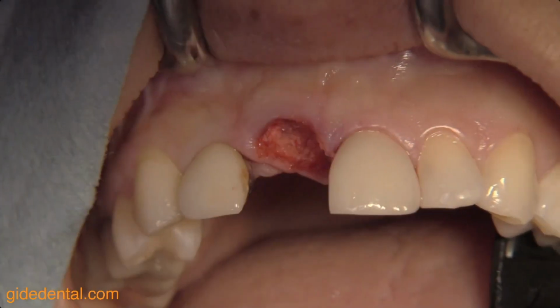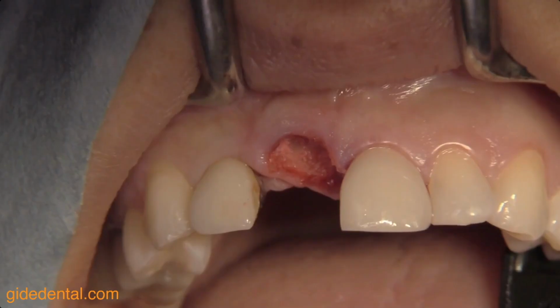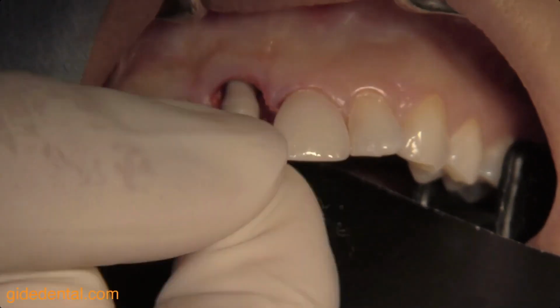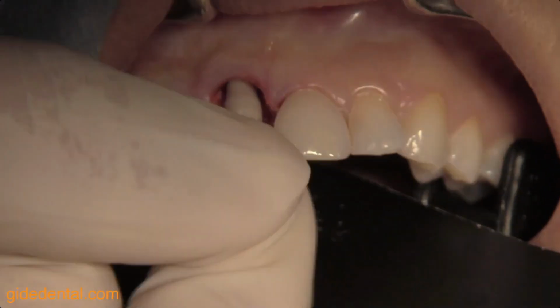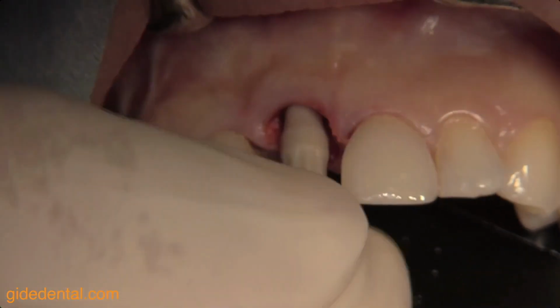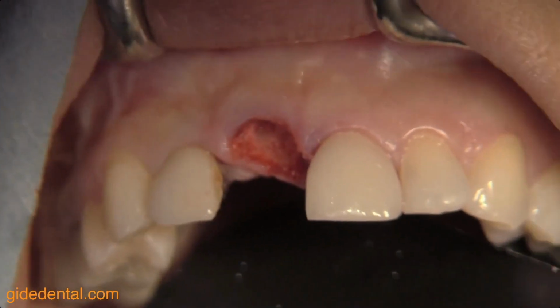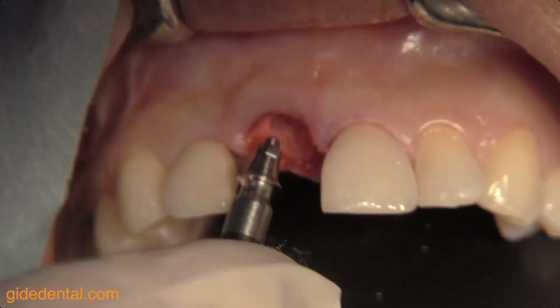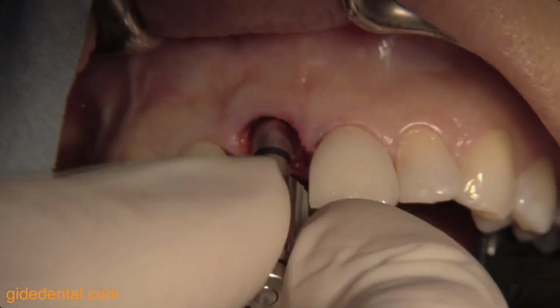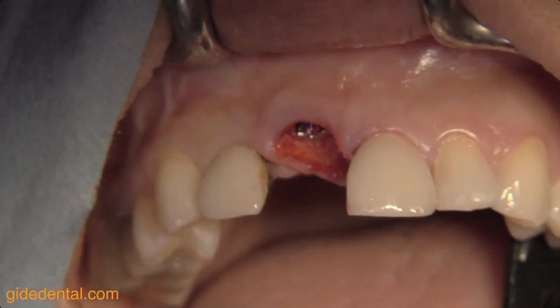The torque on this implant will need to be at least 40 Newton to do an immediate abutment placement and an immediate temporary. The abutment that I'm choosing to use here, because I have enough space, is a titanium stock abutment from Nobel Biocare called On1. So it's basically a short abutment. It's like a 1.75 millimeter height of gingival cuff. So it's kind of very limited, but in a very good way. So here you can see that.